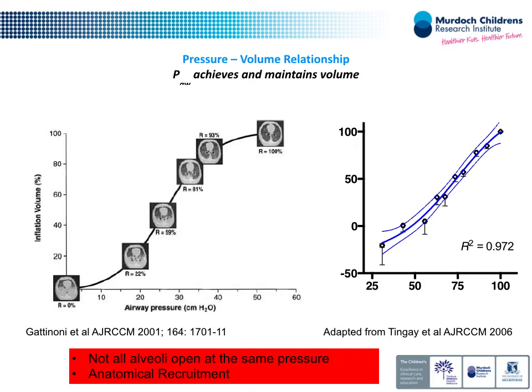Exactly, you've just preempted my next question slide. So from the clinical and whatever measure we can do with the bedside machines, how do we know exactly where we are on the best inflation, knowing that some areas could be not totally open and some may start to be over-distended, so on the safe side?